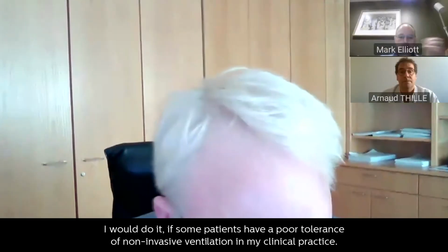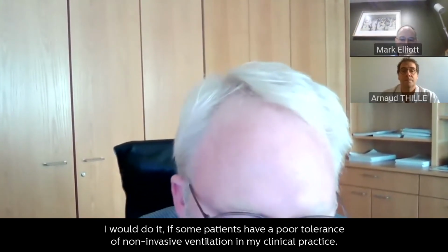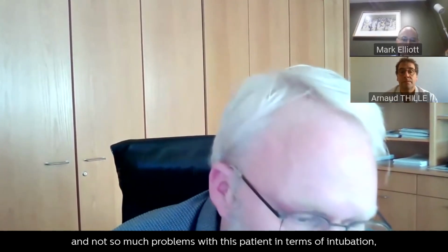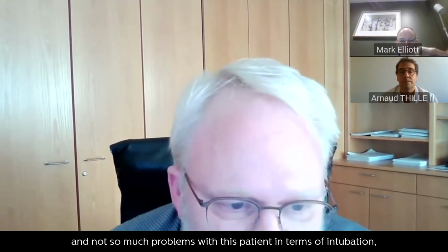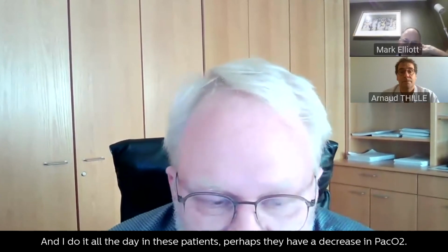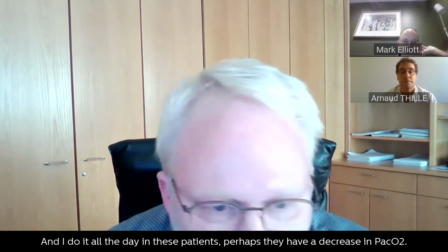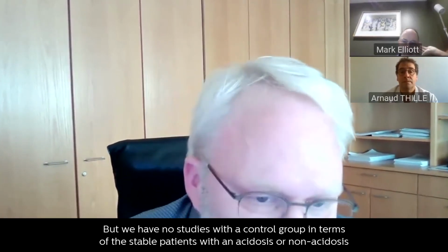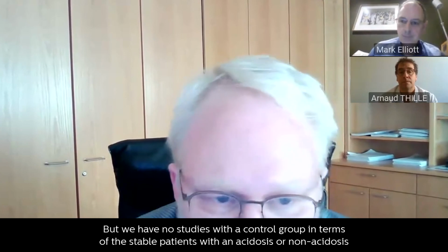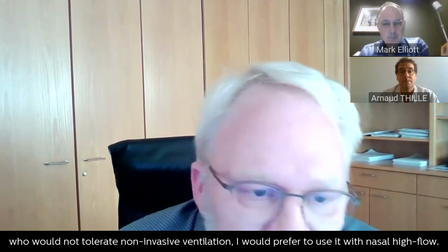I would do this if some patients have poor tolerance of non-invasive ventilation in my clinical practice. If we have good non-invasive ventilation and not so many problems with these patients in terms of intubation, I would still try to use a nasal high flow device. And I do it all day in these patients. Perhaps they have a decrease in PCO2, but we have no studies with a control group. In stable patients with or without acidosis who do not tolerate non-invasive ventilation, I would prefer a trial with nasal high flow.